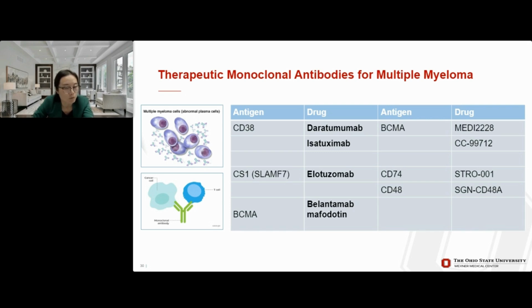Drugs like daratumumab can appear as monoclonal IgG kappa by either IFE or IT at pharmacological concentrations. They can appear as a small M protein when used in therapeutic doses.